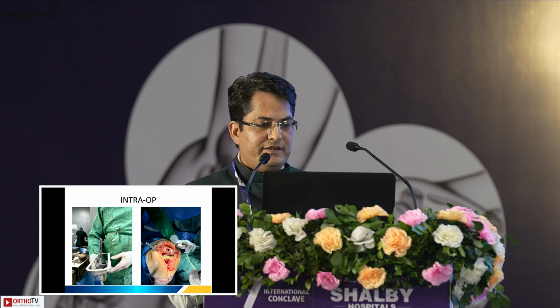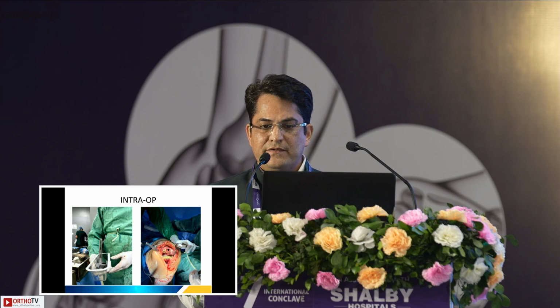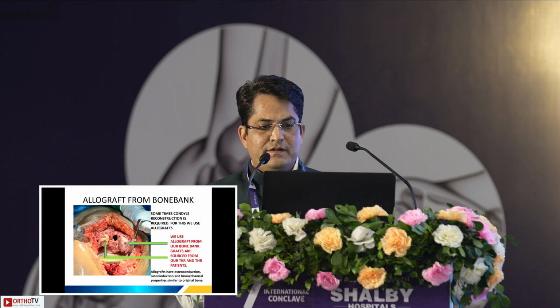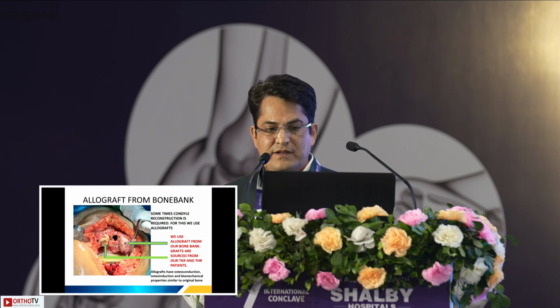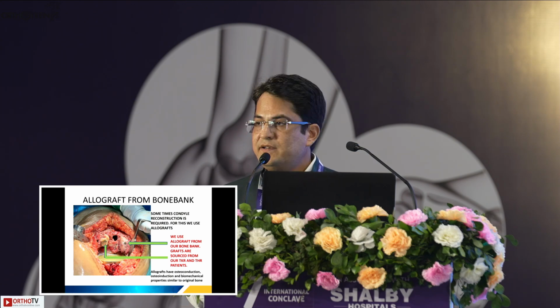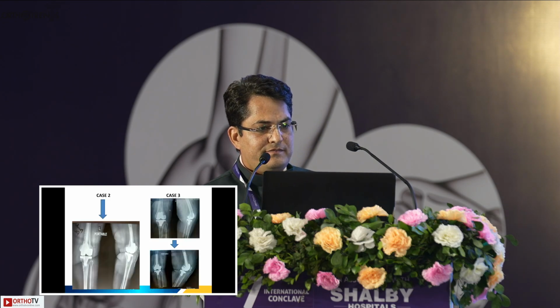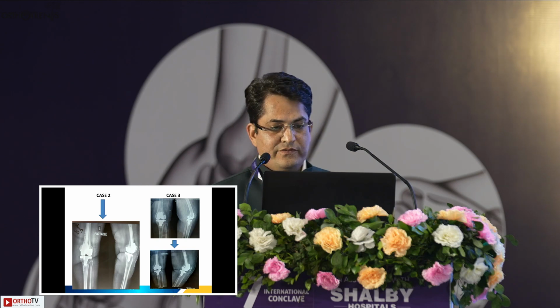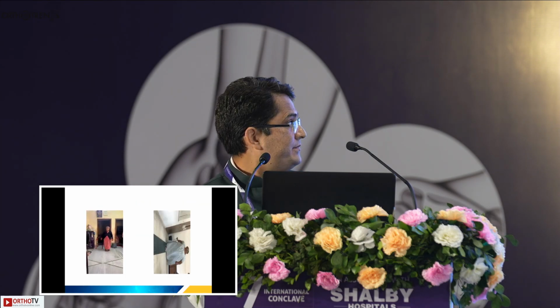So in our series, after the delayed treatment, we used allograft to reconstruct the distal part of the femur with the help of screws, and sometimes to balance the joint line, so we use augments also. Allograft has osteoconductive, osteoinductive, and biomechanical properties similar to the original bone. After case 2 you have seen the first follow-up, and case 3 also has a well-aligned implant at 2 months and 3 months follow-up, and the patients were doing well, as you can see.